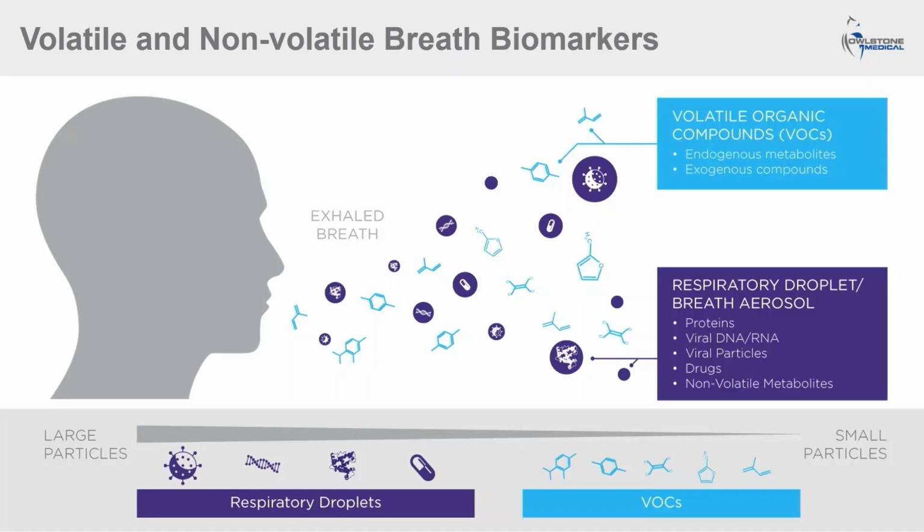By comparison, the non-volatile fraction of breath consists of respiratory droplets and aerosols that contain a variety of biomolecules. In the interest of time, I won't present the non-volatile fraction of breath in any detail today. However, additional information on its use for the detection of disease can be found on the Owlstone Medical website.